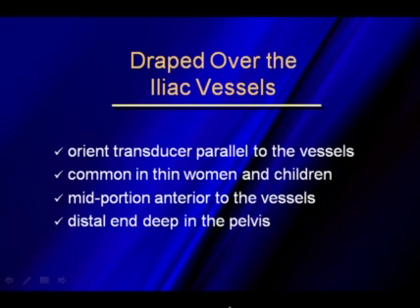So once I've identified where the cecal tip is, if I haven't seen the normal appendix arising from it, then what I'm going to do is look for it draping over the iliac vessels. I want to orient my transducer parallel to the vessels.